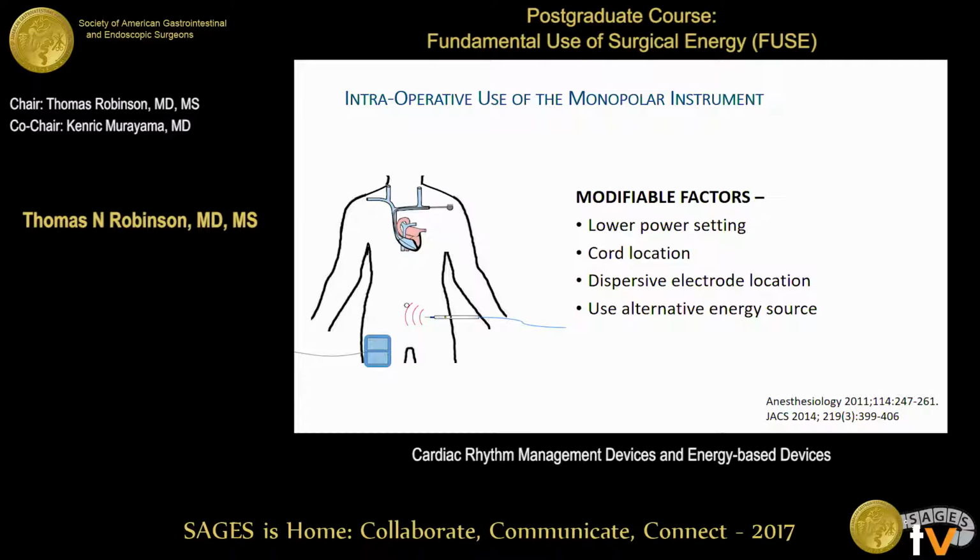So back to my question, because it's really a question for the test takers in this room. For me, the most difficult questions to answer on the test were these pacemaker questions. So could you re-answer the question, and let me put it differently: in which circumstance is the right answer not putting on the magnet? Because in our practice, that's what we would do. It's the default, and everybody thinks it's right. So can you specify again for the test?